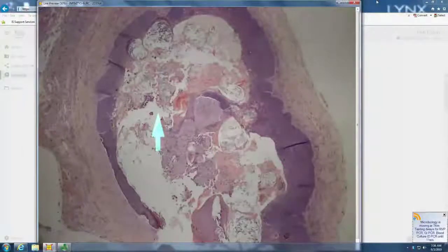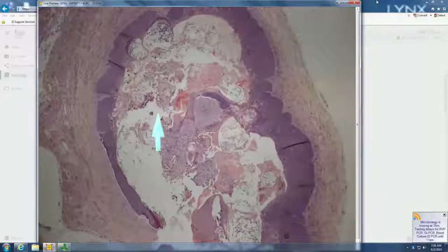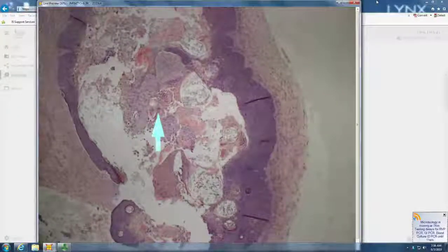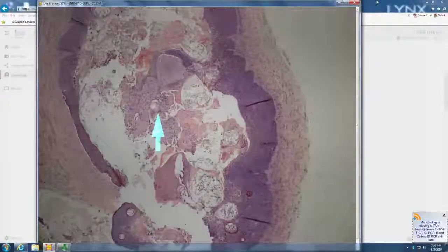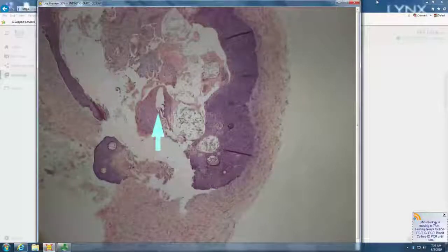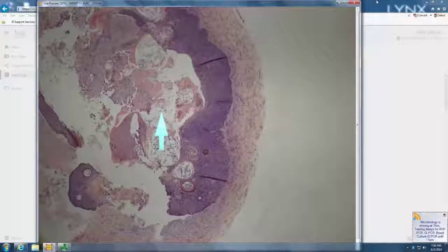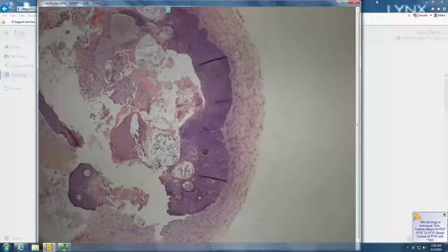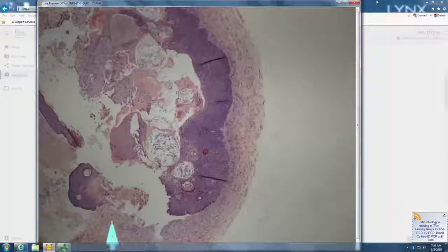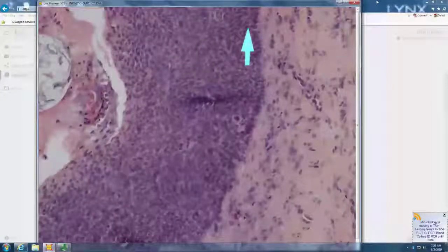We have a cystic-like cavity, with osteoid-like material, and surrounded by monotonous blue cells. So poroma. So you thought poroma, given the cystic cavity. Now, poromas form ducts. Does this form ducts or does this form keratin cysts? Keratin cysts. This one's doing keratin cysts. Poromas never, ever, ever palisade. Does this have a palisade? Yes, it does.